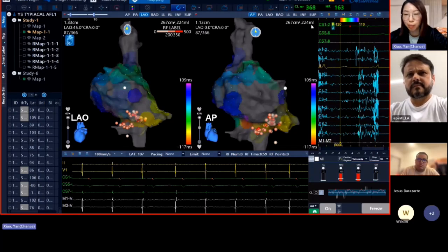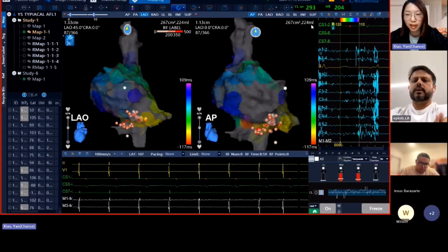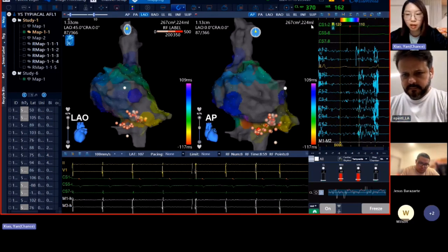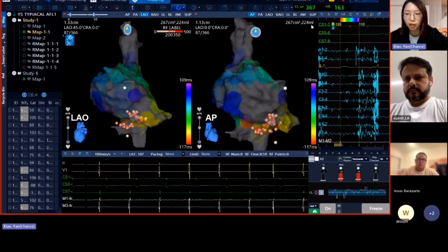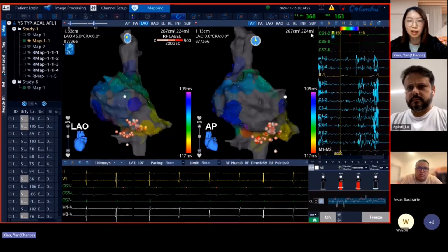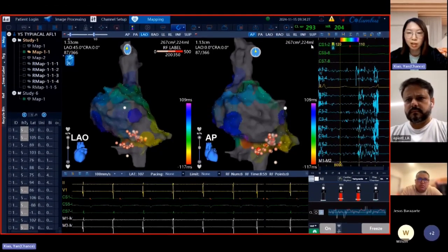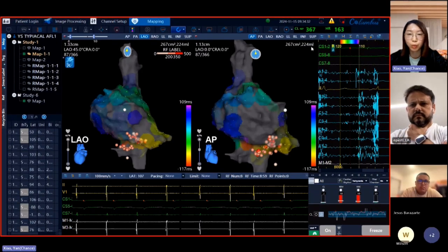Now you will upgrade to v4.4002. So today I would like to present the new features compared with software version v4.4001. And we also care about this first case. Wilson arranged this part, and Mr. Ben also attended this meeting. So after this update, Mr. Ben will share his comments and experience with us.